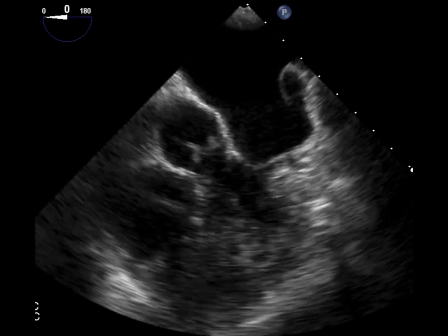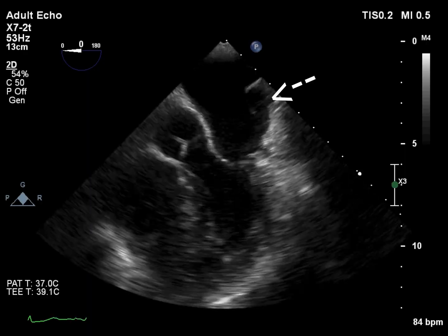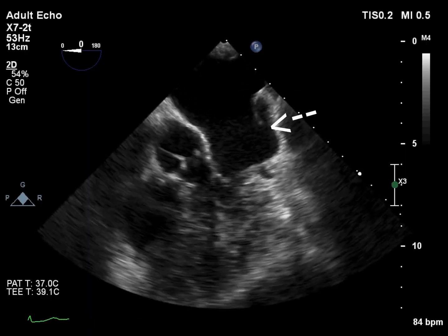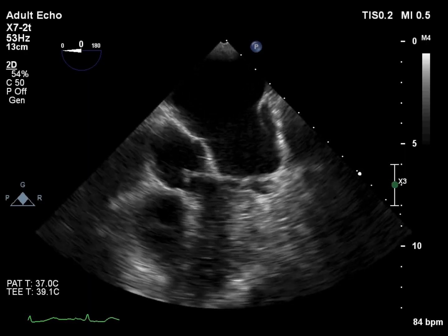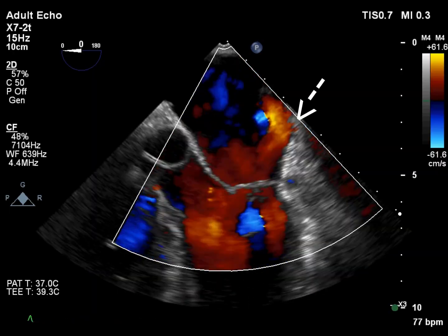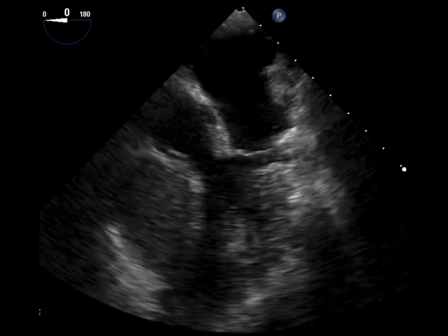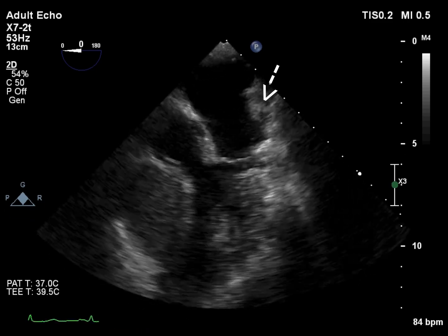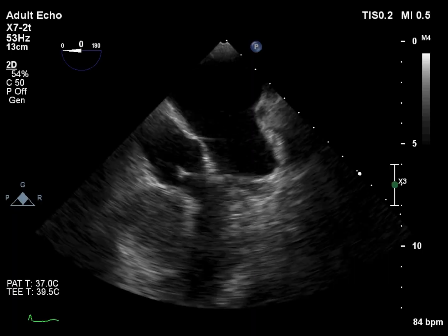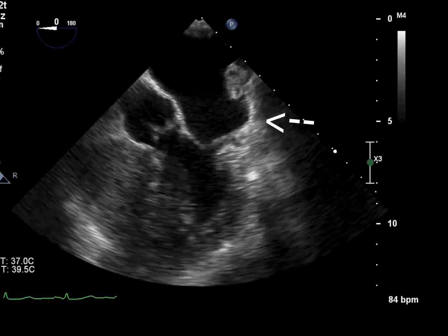This view shows the left atrium and a dilated coronary sinus on the left. However, the inferior part of the coronary sinus is not intact. Color Doppler imaging reveals turbulent flow specifically in the coronary sinus region. This contrast study shows the contrast draining into the coronary sinus, with contrast bubbles passing through a defect in the inferior part of the coronary sinus.